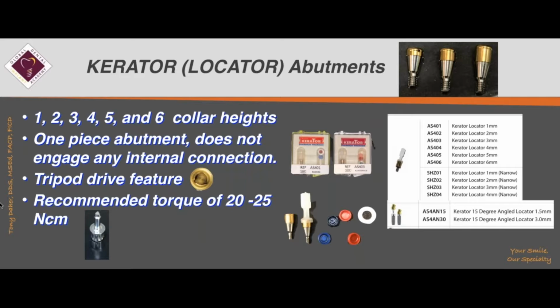And you have a tripod drive feature, so with a special driver you can torque that abutment to a value of 20, at the most 25 Newton centimeter.